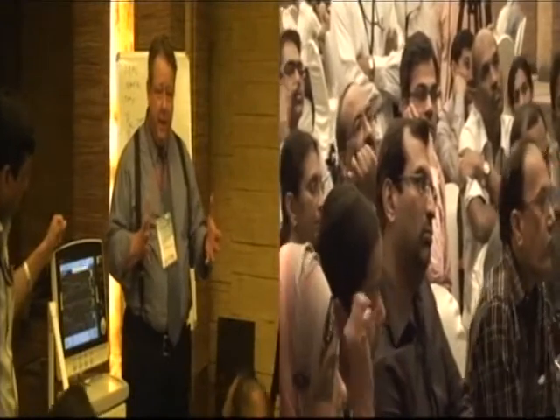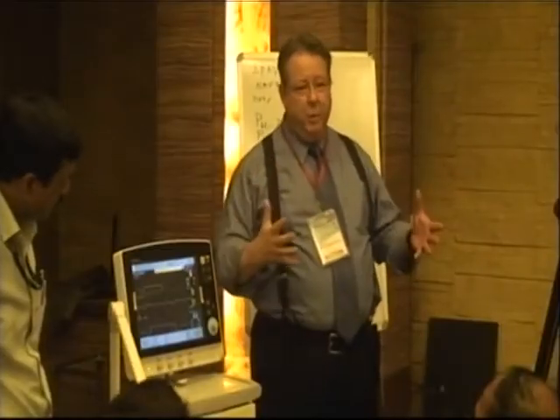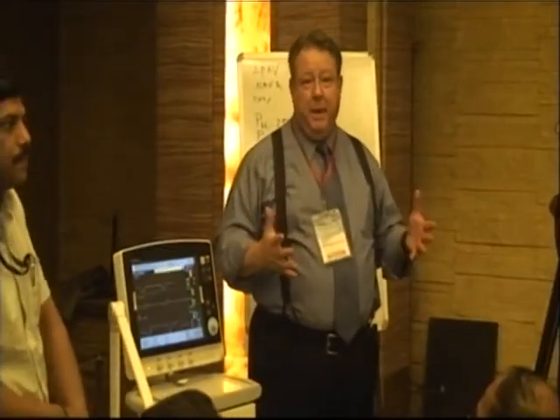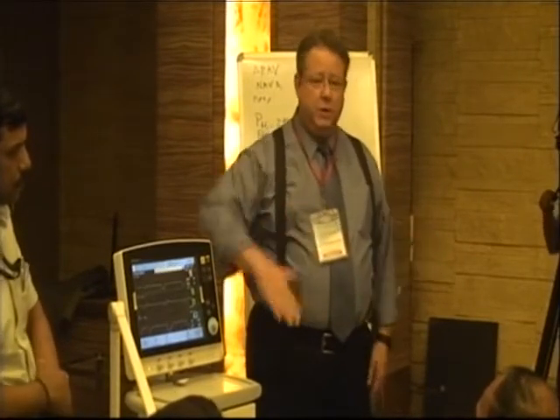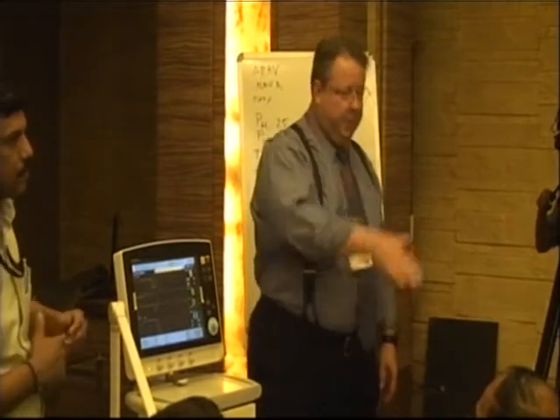So you drop it down, and we'll talk about how much to do that, but you drop about 50% of the flow comes out in that half a second to 1 second, and then you go right back up to that high plateau again, and then you breathe across that. And you might release them every 4 seconds, every 3 seconds. It sort of depends on what the patient's able to do and how well the ventilation is going. So they're breathing across the high peak, they drop, they come back up.